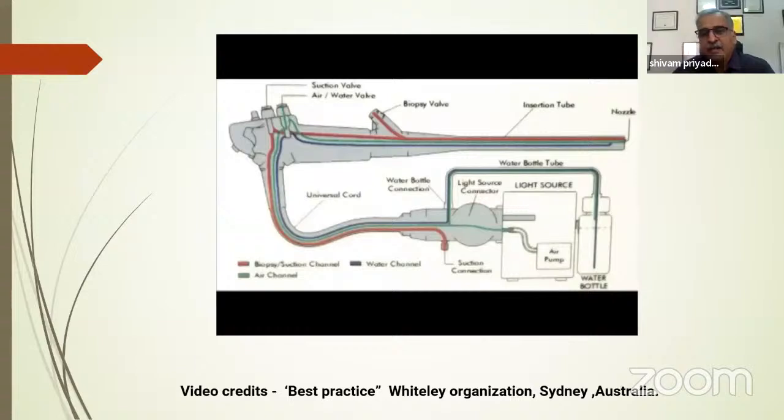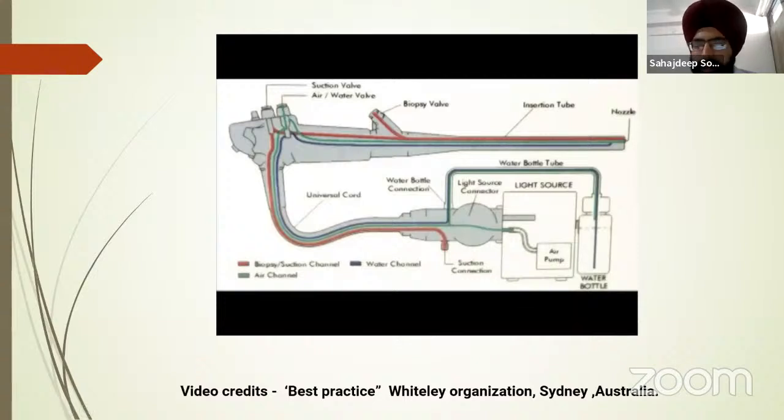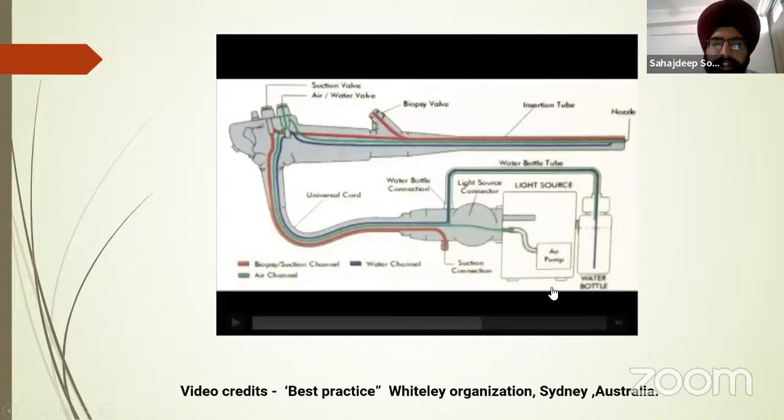Okay, let's complete your video first. Yes, sir. Then these are the two important points, sir. Brushing of all channels, and then comes the water rinse.